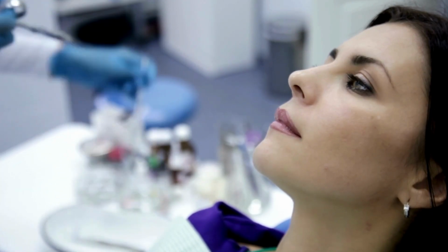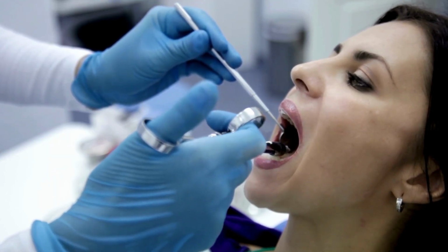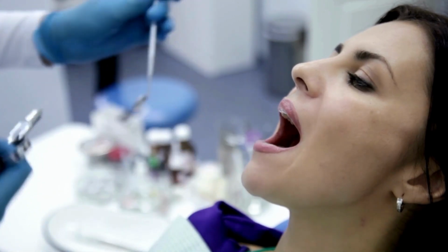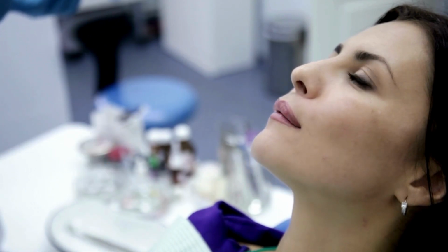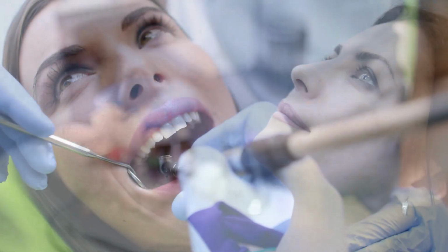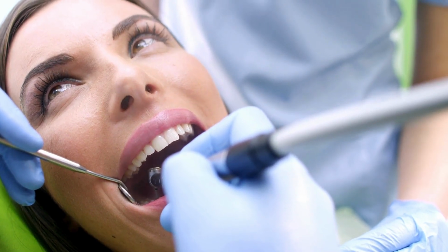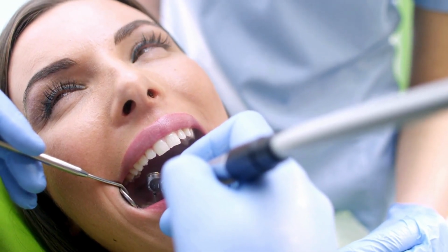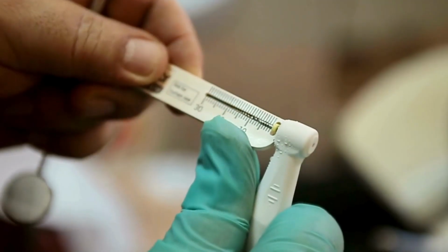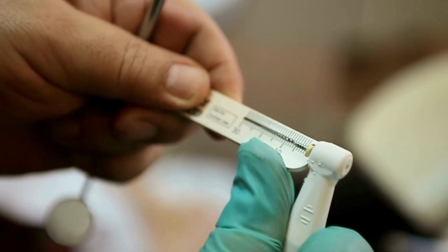Detection of the problematic tooth by taking radiography, anesthetizing the tooth and surrounding tissues with regional anesthesia, isolating the tooth from surrounding tissues, preparation of the endodontic cavity for entry into root canals, determination of working length using electronic devices and confirmation by radiography, reshaping of the root canal space, destroying microorganisms with various root canal disinfectants when using rotary instrument systems in root canals. Cleaning the root canal space.